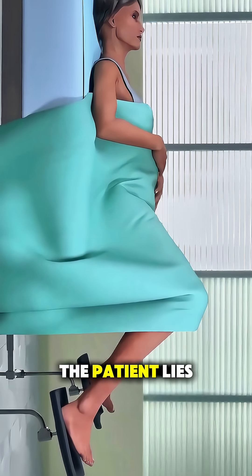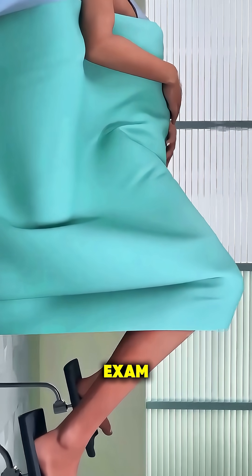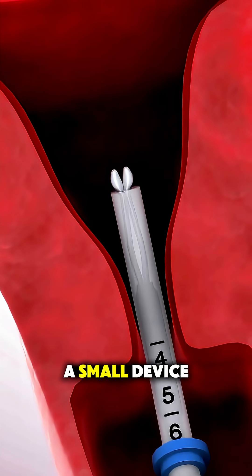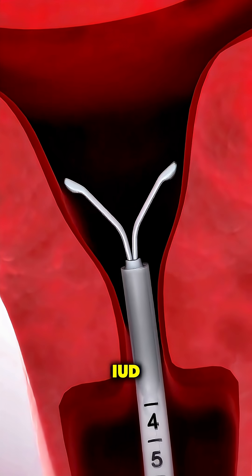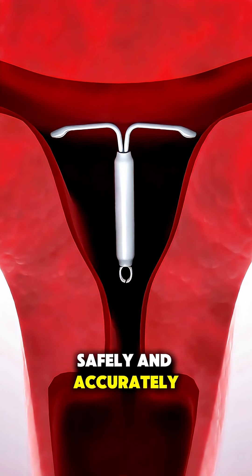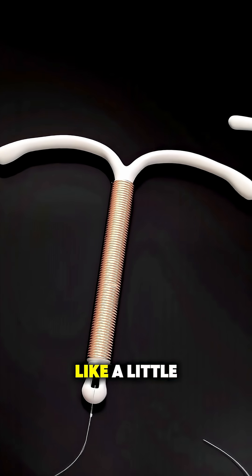During the procedure, the patient lies back, just like during a regular pelvic exam. The provider gently checks the position of the uterus, and then uses a small device to place the IUD. This device is designed to guide it safely and accurately. The IUD itself is tiny, flexible, and shaped like a little T.